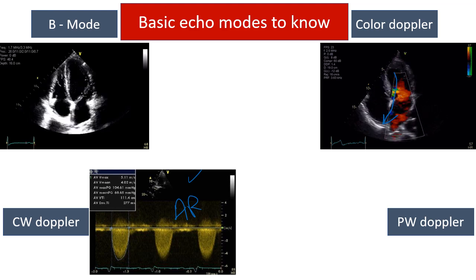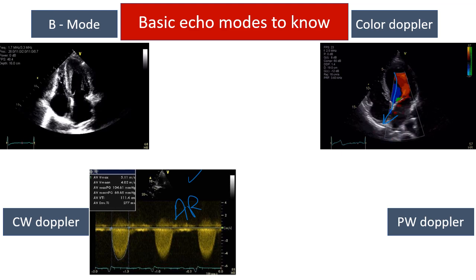And also, you can get the maximum velocity across the valve. You know that if any liquid is going through a stenotic segment, its velocity increases. So this can be translated that when you put the continuous wave Doppler line across the valve opening, you can get the maximum velocity across the valve. And we have certain readings regarding the maximum velocity for each valve, above which it is considered a stenosis. So this can aid us with the color Doppler to identify valvular lesions like stenosis or regurgitation.